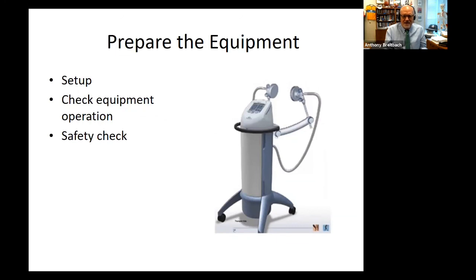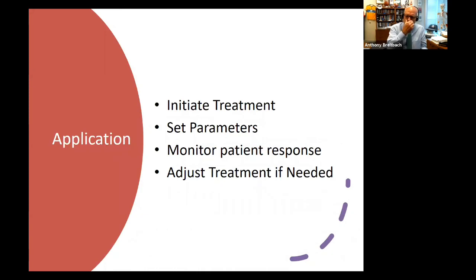You do the setup. We also want to check the equipment operation, make sure the equipment is positioned appropriately and it's operating safely. So then we get to that application. We want to initiate treatments. We want to set the parameters. We want to monitor patient response and adjust the treatment.